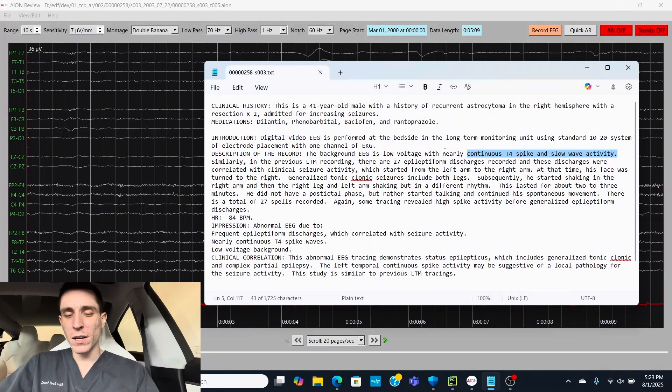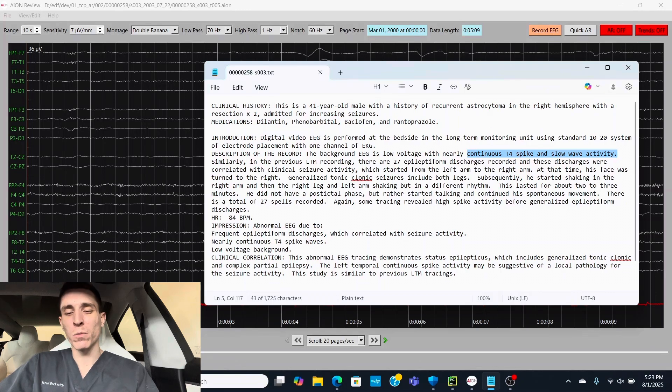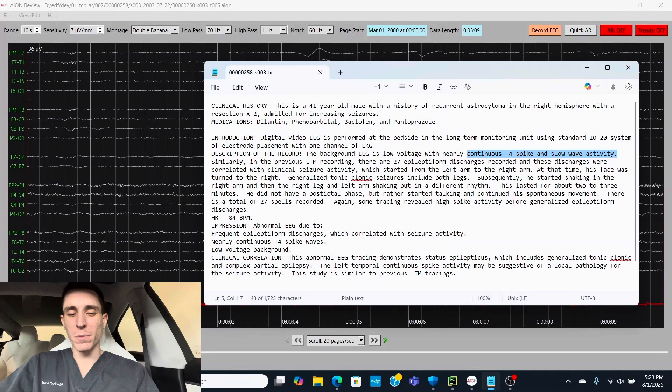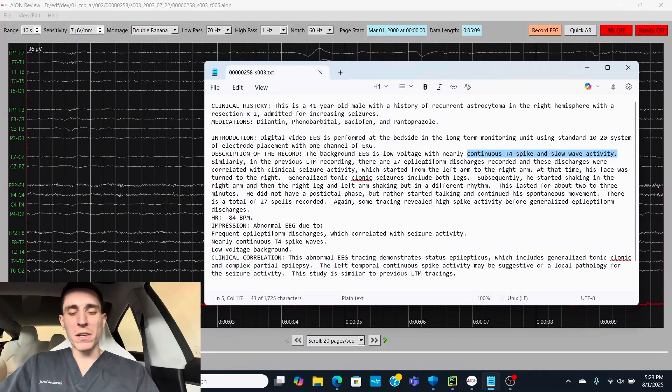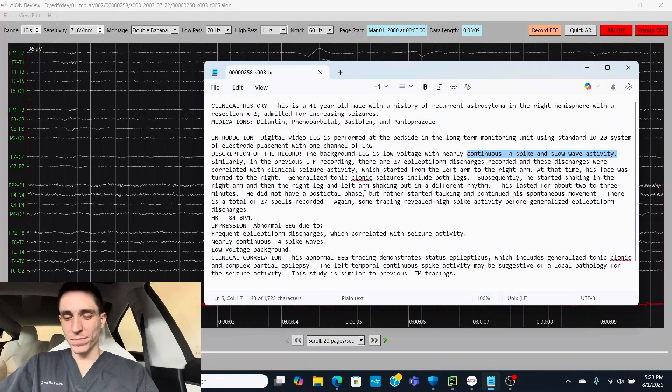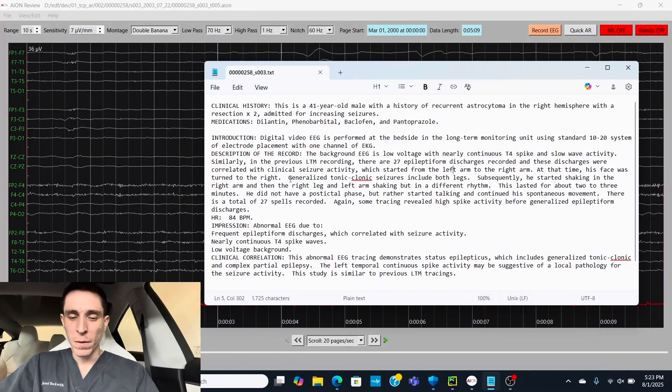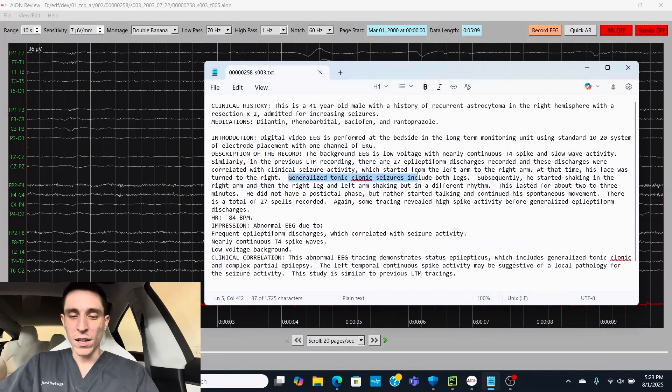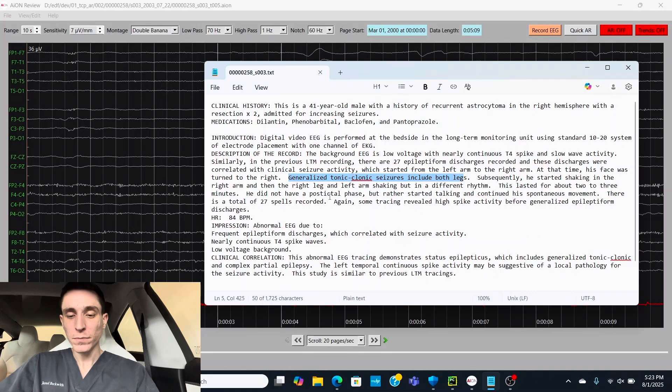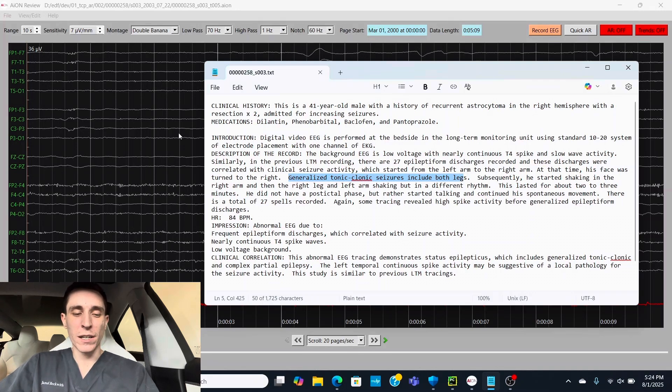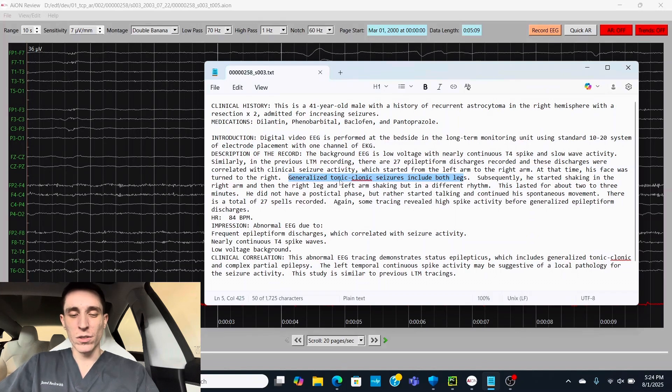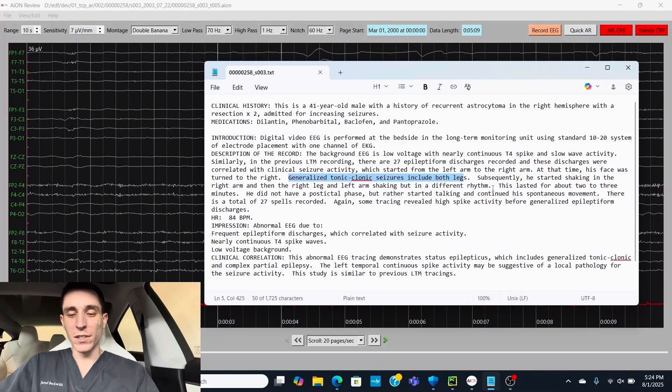So if you're reading a patient's history and you kind of already know what to expect, where the tumor is, where the spike in wave activity is to be found, it can really help make your viewing of an EEG more efficient. Now it looks like he has focal seizures in that T4 area, but also generalized tonic-clonic seizures. So it's possible he has epileptic activity that starts out in the T4 area and then just spreads to the entire brain. And he has those generalized tonic-clonic big seizures.